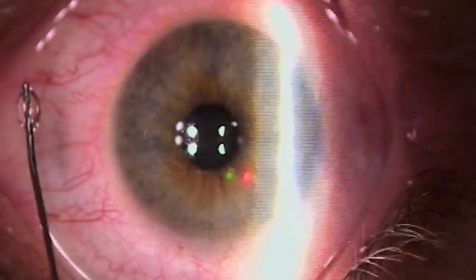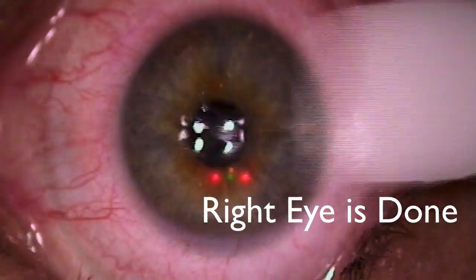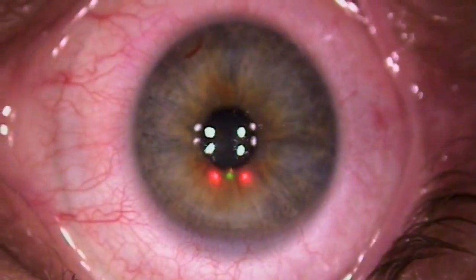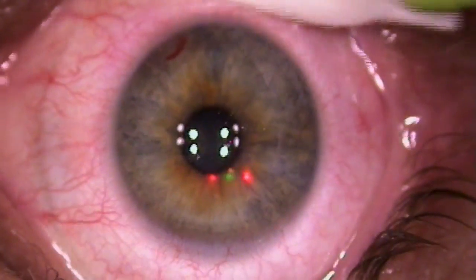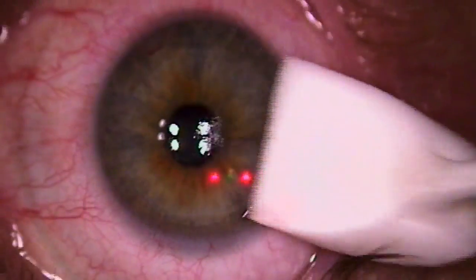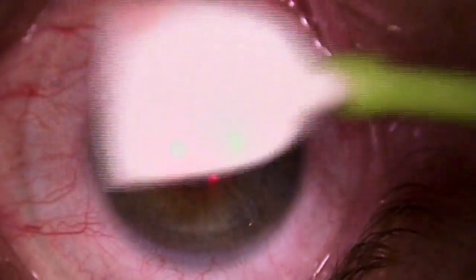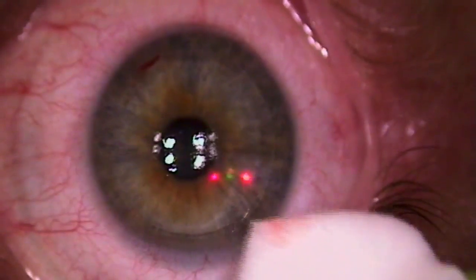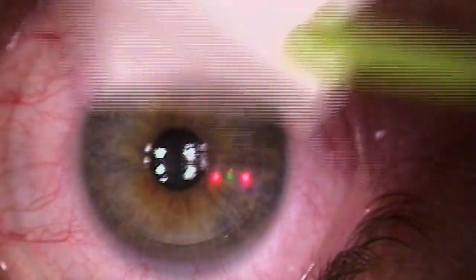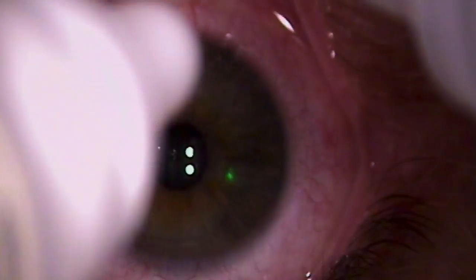That was it — you did really well. I'm going to tickle you here a little bit like that. You're doing okay — he's great up here. Extra antibiotic drops.